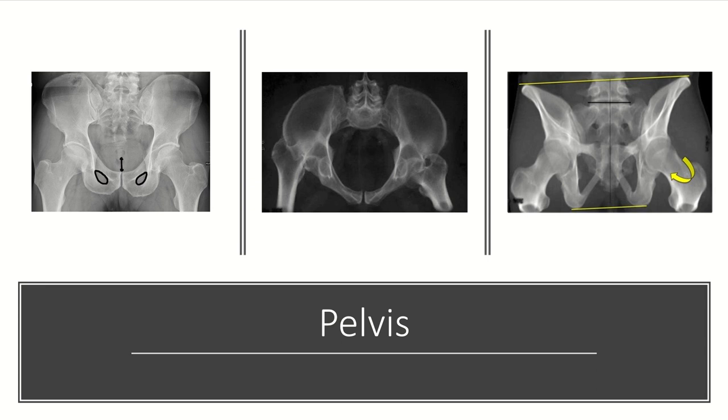On the pelvis x-ray series, we typically get an AP, a pelvic inlet, and a pelvic outlet view. On the AP, the spinous processes should be midline, the space from the pubic symphysis to the bottom of the sacrum should be about two centimeters, and the obturator foramen should be symmetric, which suggests the pelvis is not rotated.